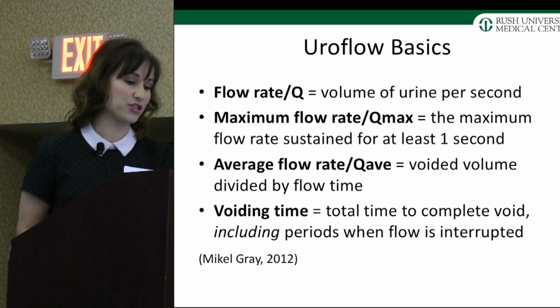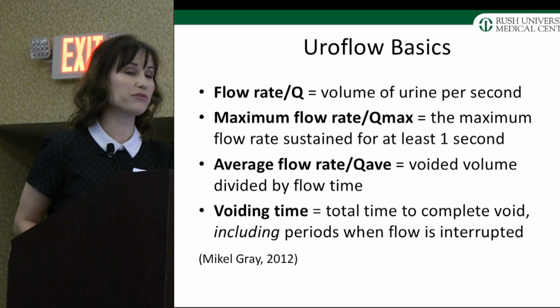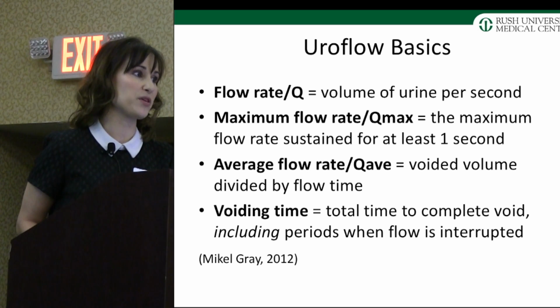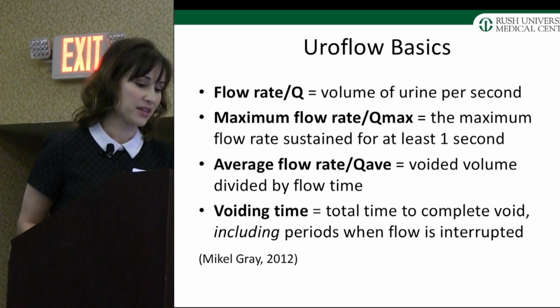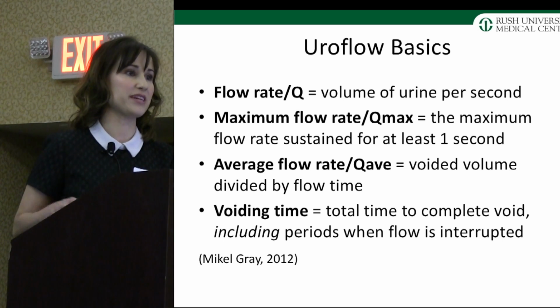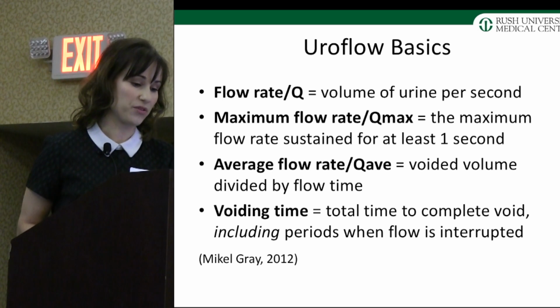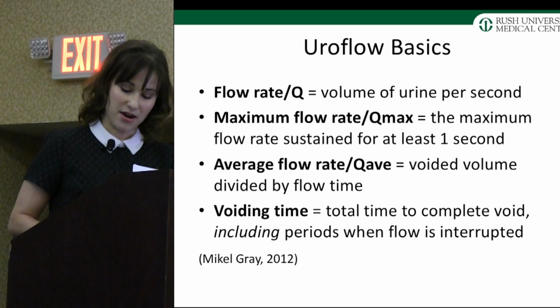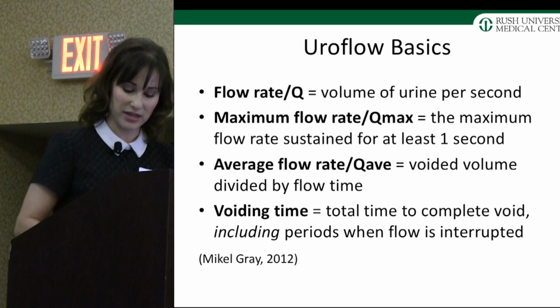Flow time, that's the total amount of time that the actual flow includes. So they're going to subtract periods of time when the patient's not urinating. And then the time to maximum flow, so that's the amount of time it takes for them to reach that peak flow and hold it for 1 second. And then, of course, your voided volume, just the number of milliliters that the patient's voided.